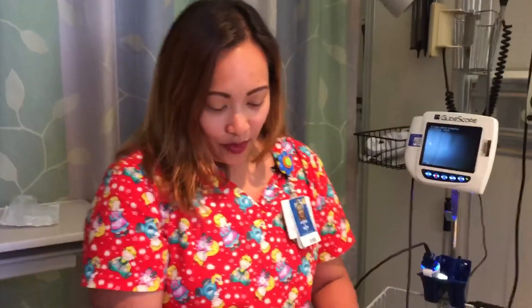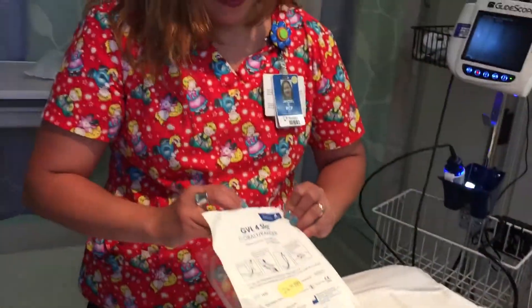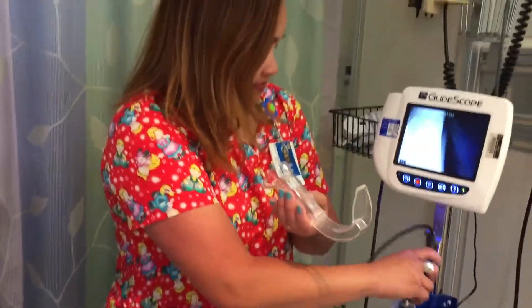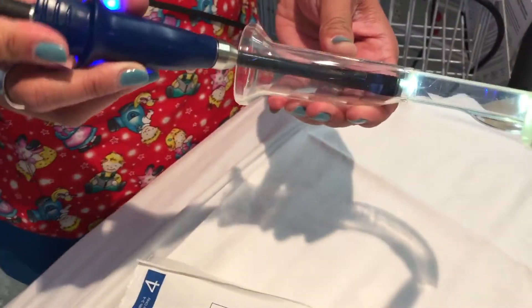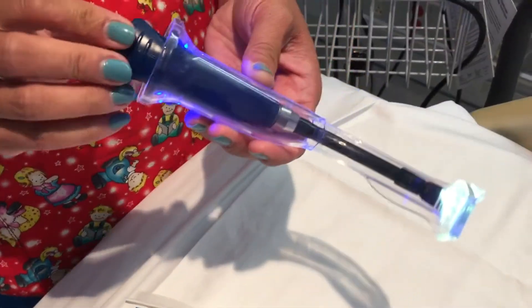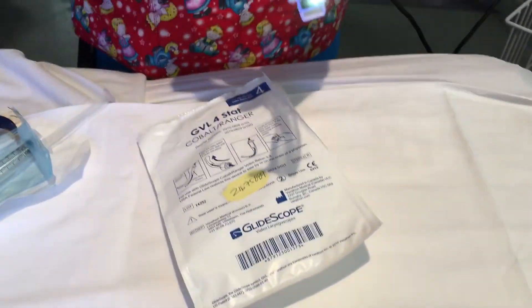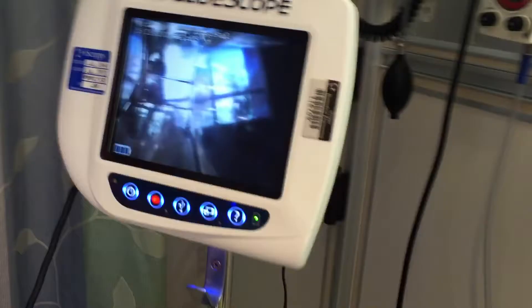Now let's set up your blade. I use the size 4 blade. We need to grab the videoscope and insert it inside the blade. We have to make sure that we insert it all the way in so that we can have good visualization of your cords. If it's slightly out, then you will have visualization of the blade instead.